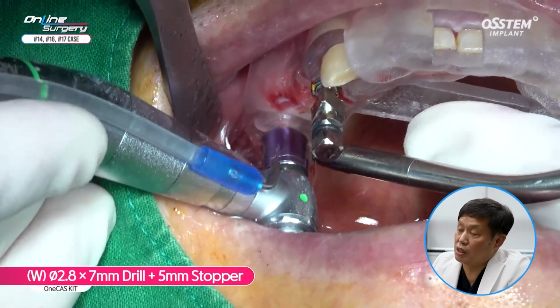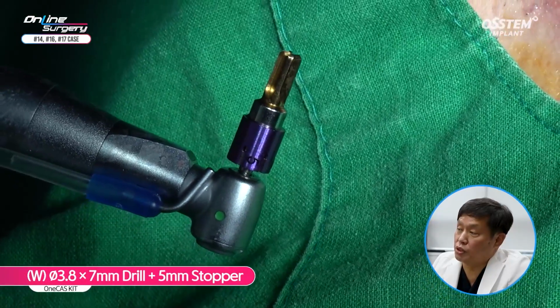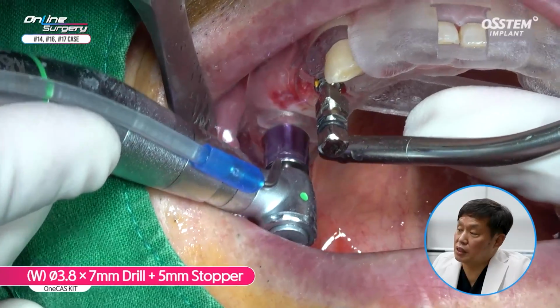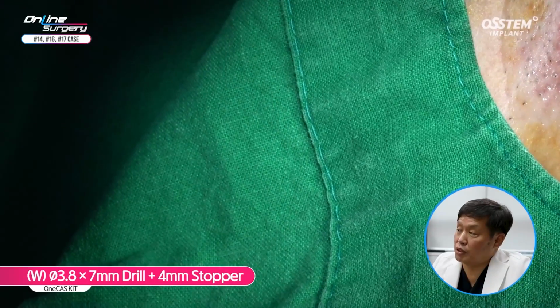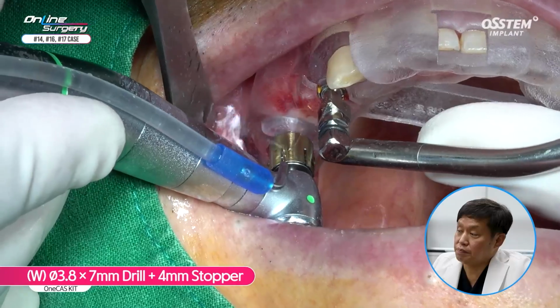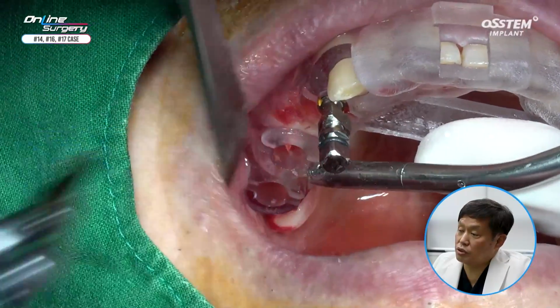2.8 by 7 millimeter drill with 5 millimeter stopper was used. Diameter 3.8 drill with 5 millimeter stopper was used. Drilling was done up to the final diameter. We're going to proceed gradually. 3.8 by 7 millimeter drill with 4 millimeter stopper was used. Drilling was done up to 3 millimeters.